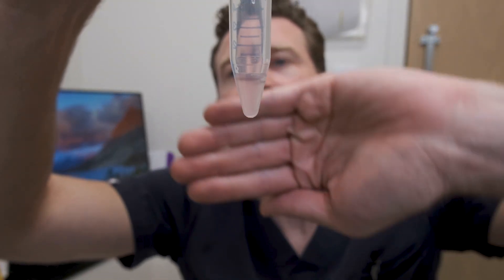Here is my study design: one test will act as a positive control with a high concentration of sperm. One will be a negative control with no sperm. And the third will be the challenge — a low concentration sample that does have sperm in it.